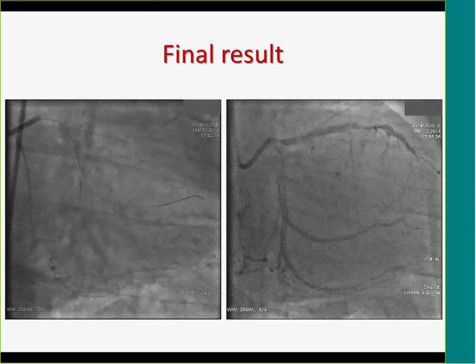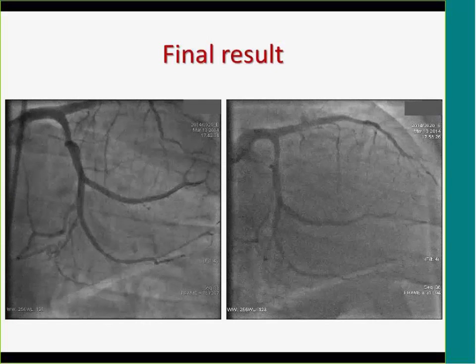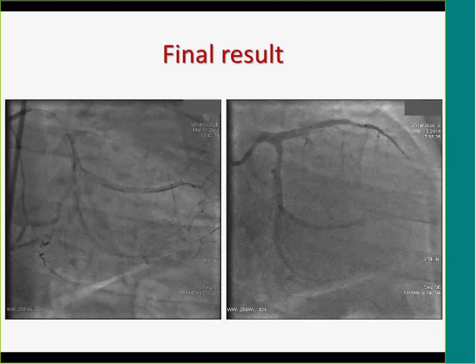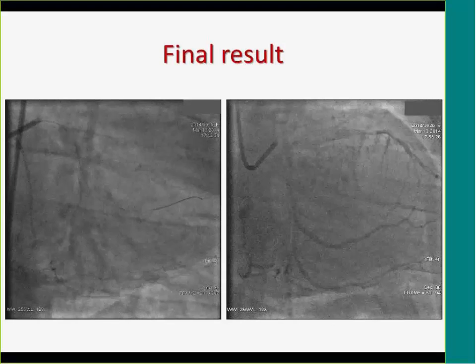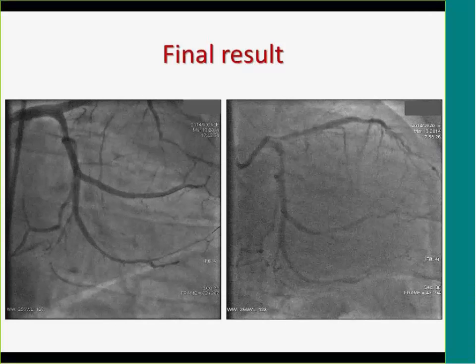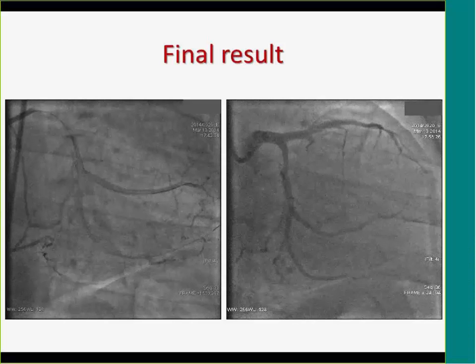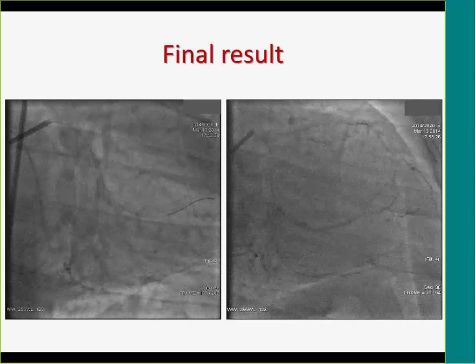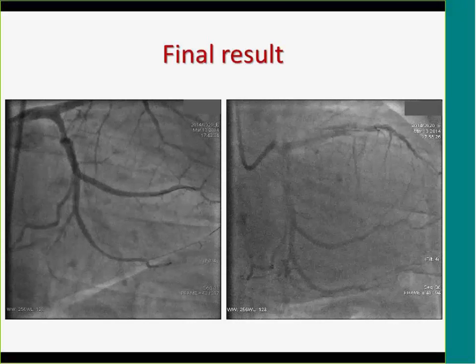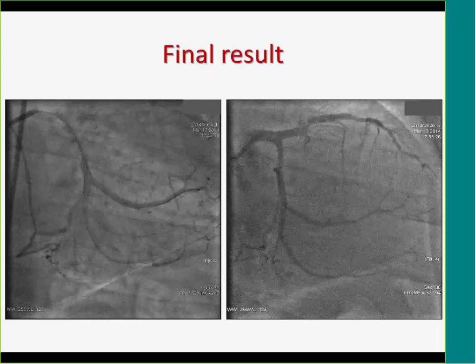Yeah, I think another alternative, I think George Sianos just actually had a case like this, is he put a smaller GuideLiner inside the guide and did the trapping of the retrograde wire inside the GuideLiner instead of doing it inside the main guide. So then this way he could trap, advance the retrograde microcatheter without having the issue with the single guide catheter and affecting the other part of the wire. So it's another way to do it, but I agree with you. I think it's very challenging. Going through a stent can be a problem, but of course you didn't have any choice here. The patient is unstable; he needed a stent anyway.